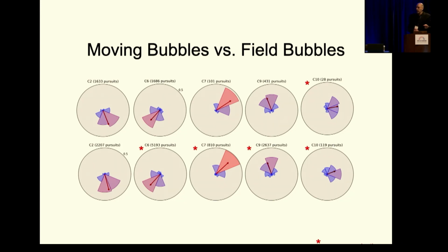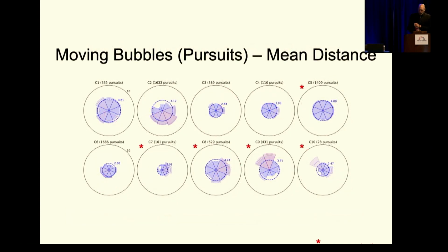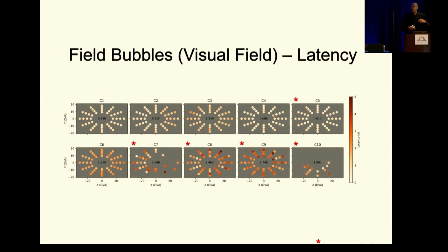So now we have a way of measuring not once, but repeatedly, and even in circumstances where you have treatment at hand. The moving bubbles thing is a much more difficult thing to quantify, but normally what you have is a system, again, of these different orientations and degrees of movement in those orientations that we can quantify. The field bubbles, looking at your ability to perceive things in different visual fields, we can calculate not just spatially in visual fields, but how quickly you move in that.